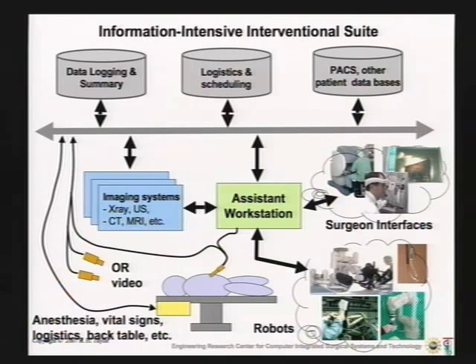If you look intraoperatively, where we're headed with all of these things is that the operating rooms really themselves are going to be integrated systems closely tied to all of this information infrastructure and things like that language of surgery. One possible use is just simply to diagnose what went wrong. You really can become a flight data recorder of the operating room.